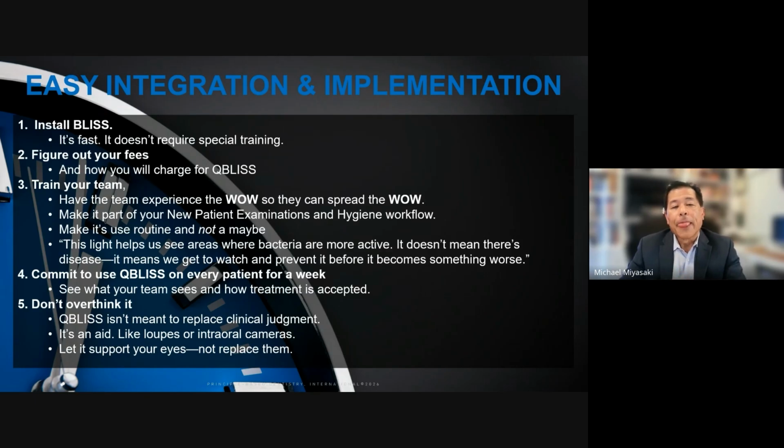Train your team. Have your team go through with the cameras, and now they get the wow. Now I can see where I'm missing when I floss, or I can see where my teeth are breaking down, and they can spread that wow. Because if your team can express to the patients, you know what, I didn't think I had gingivitis, or I didn't think I had any gum issues, and then I used this camera and I saw where my gums were red, it's going to help the patient say, okay, let's do that.